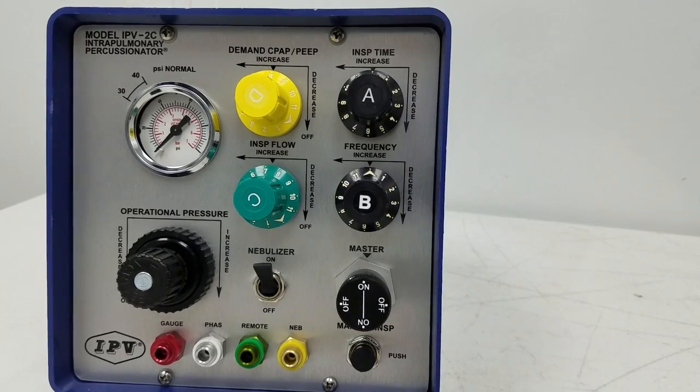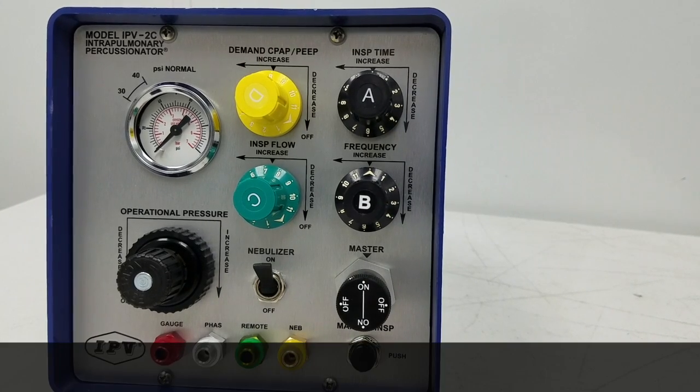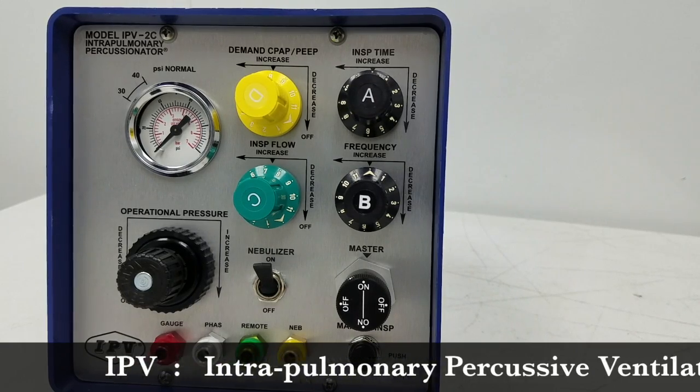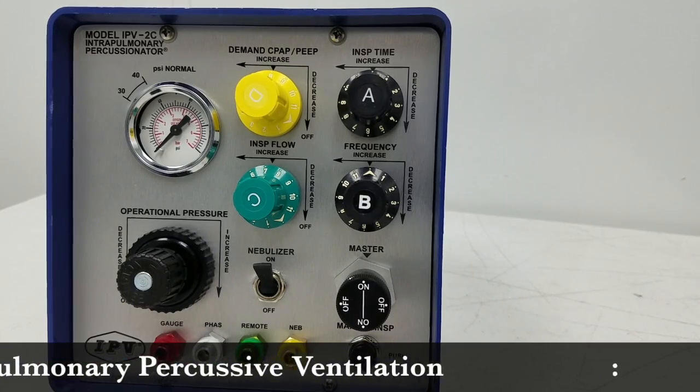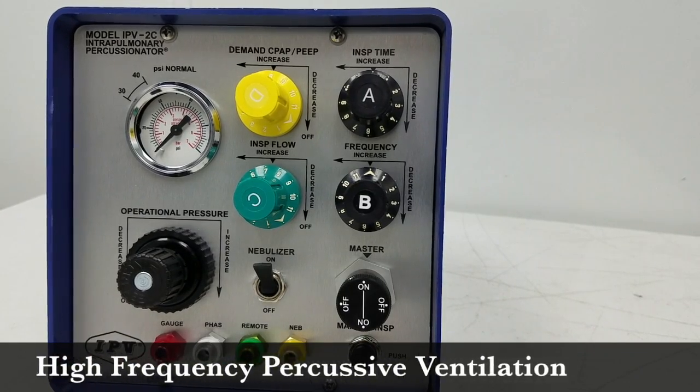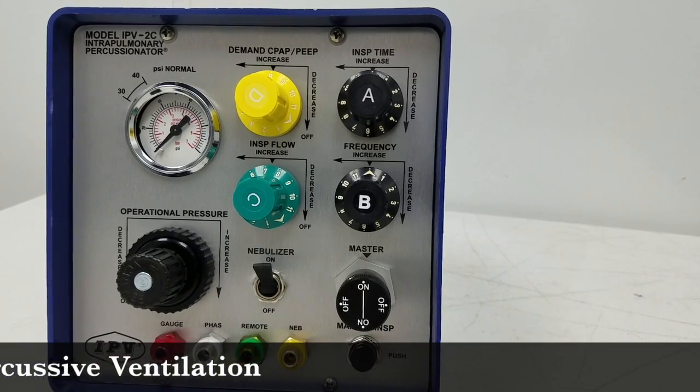If you're not familiar with this device, it is called IPV, or intrapulmonary percussive ventilation. It is categorized as a mode of ventilation — it's actually known in textbooks as well as in literature as high-frequency percussive ventilation.